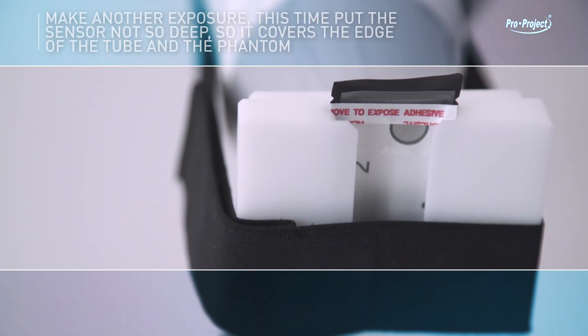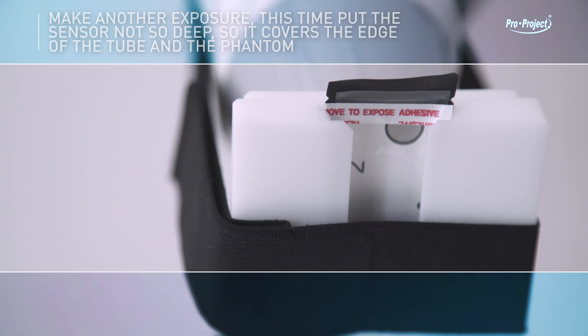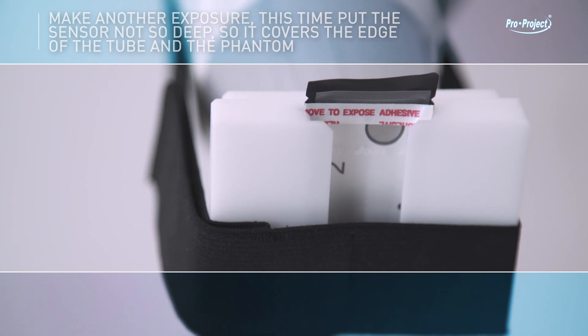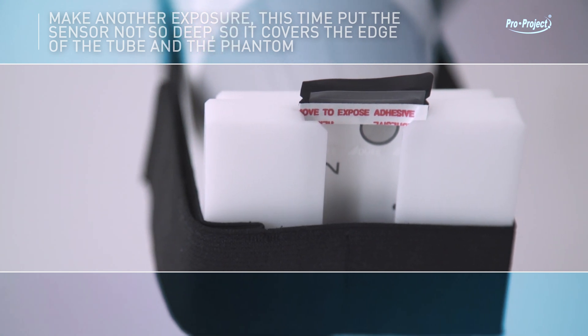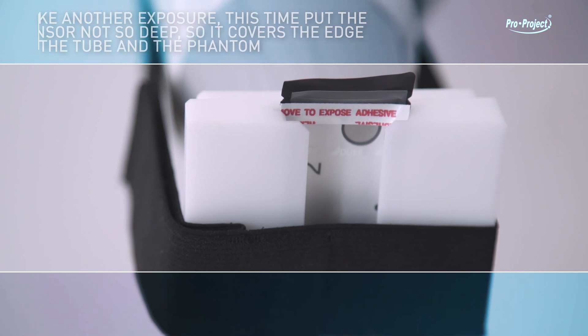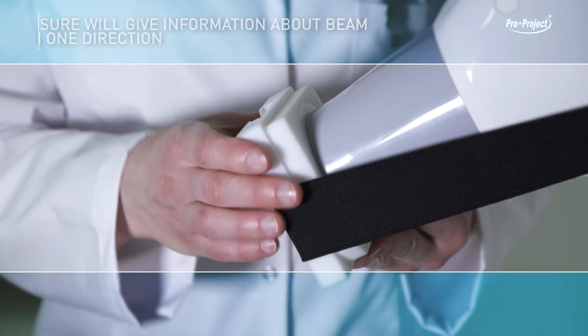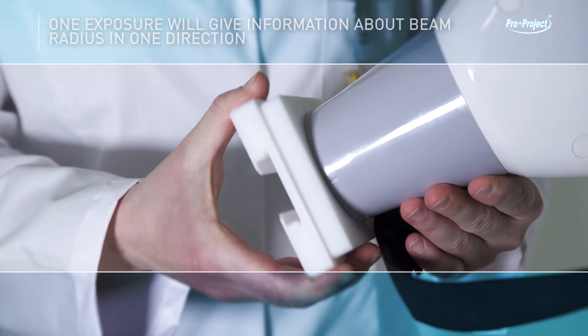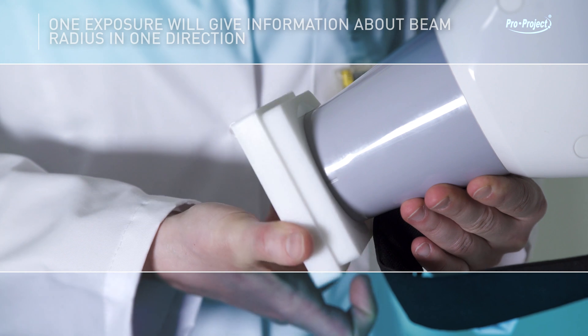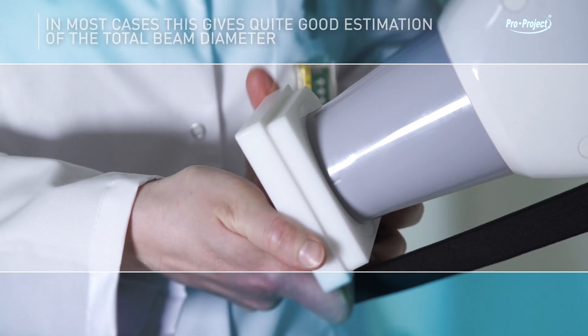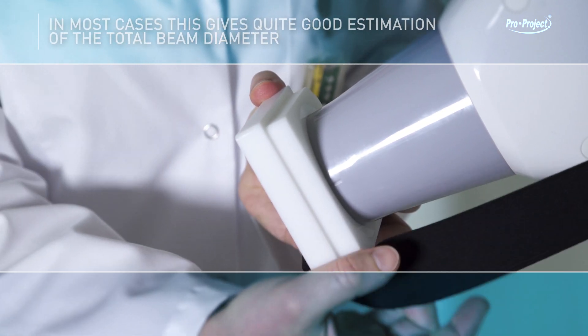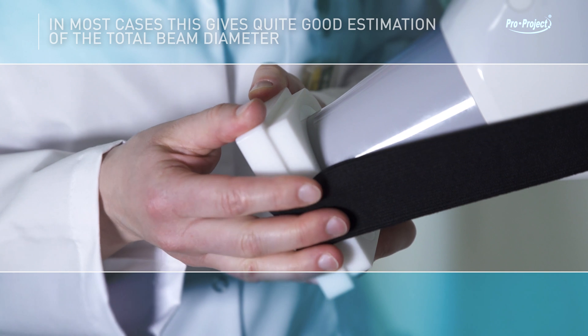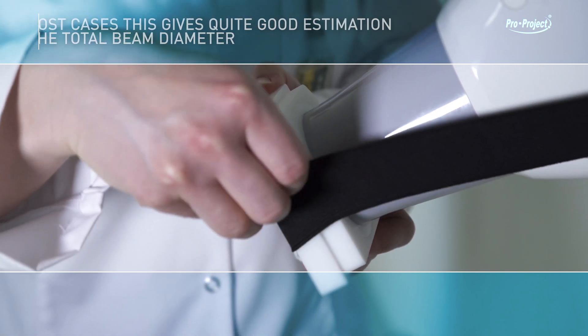Make another exposure. This time, put the sensor not so deep so it covers the edge of the tube and the phantom. One exposure will give information about beam radius in one direction. In most cases, this gives quite a good estimation of the total beam diameter.